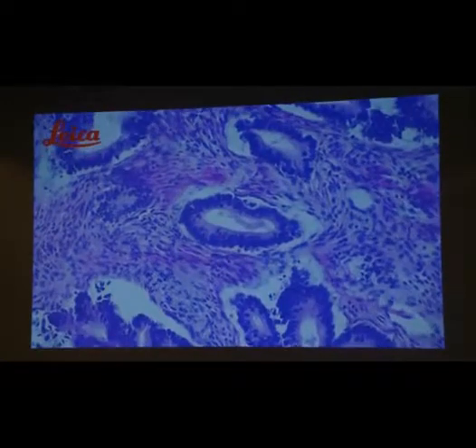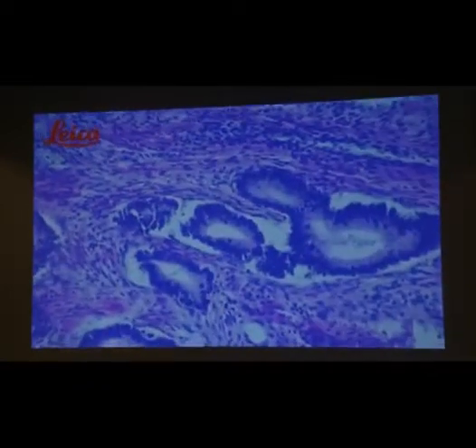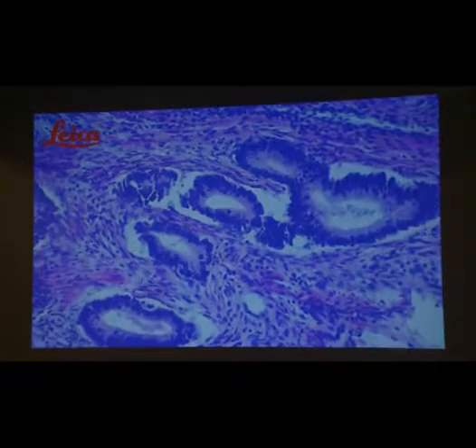It looks like this. Alright, so again you have glands, more or less mucin. Then you go to higher power, and you can easily detect the mitotic figures all over the place, right? Stratified nuclei, elongated nuclei, and all the other characteristic criteria are easy.